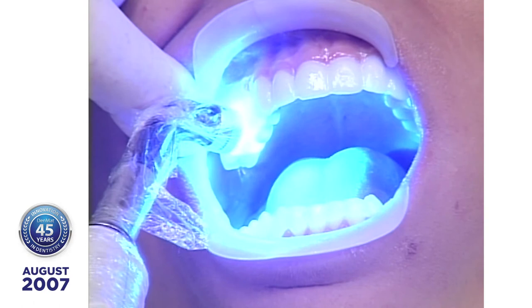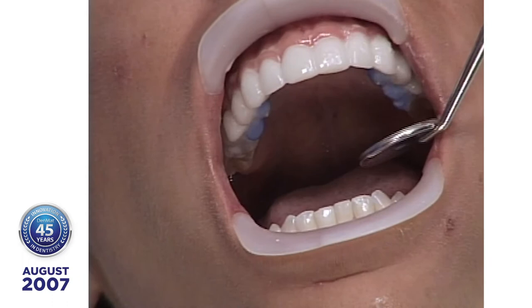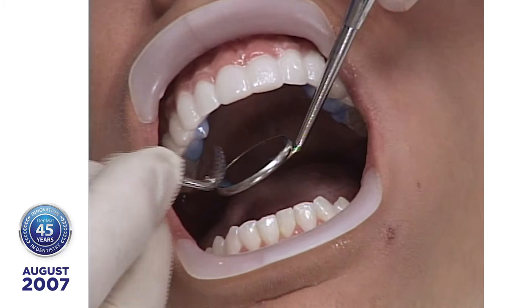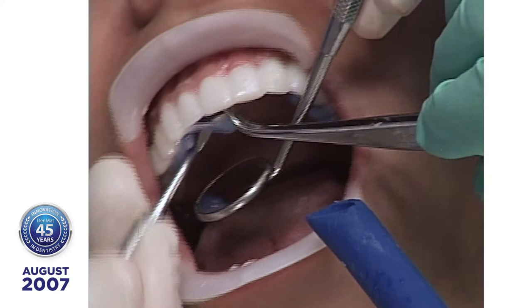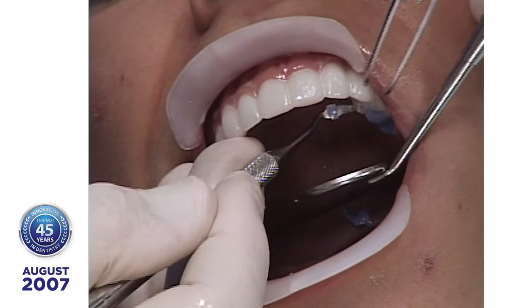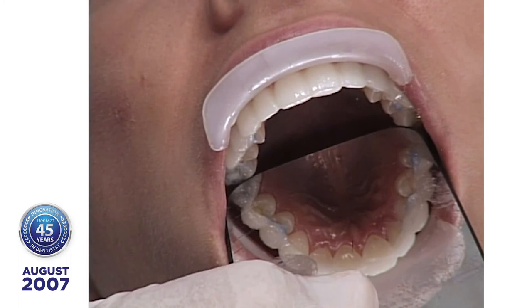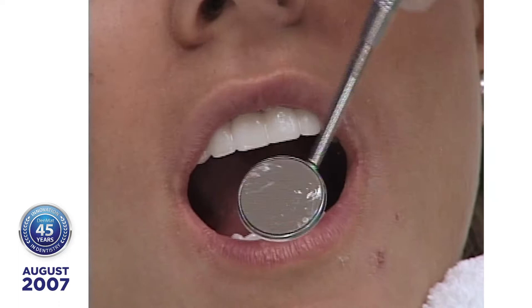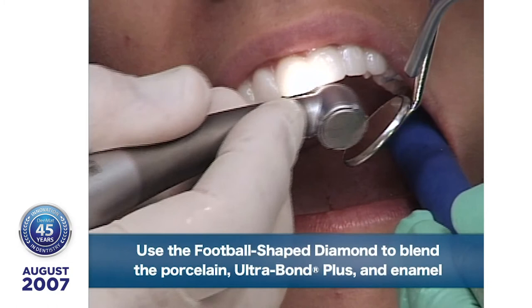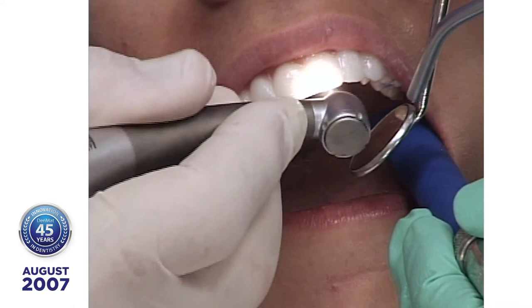I want to show everybody the lingual side. Can you all see how this looks on the lingual side? We'll take the paint-on dental dam off and put a little pressure on that. Take a look at the lingual side — it's all cleaned up. Now I'll take the football-shaped diamond and remove the excess. I go on the lingual side and blend the ultrabond, the porcelain, and the tooth structure all together so they're one solid, homogeneous mass.